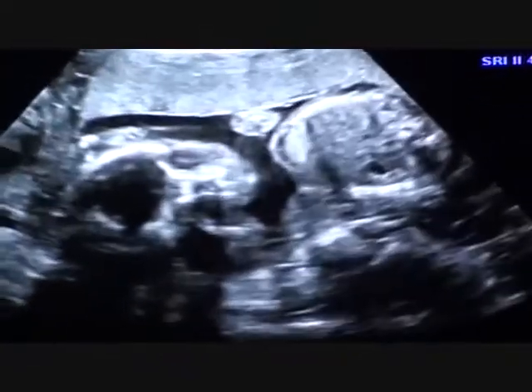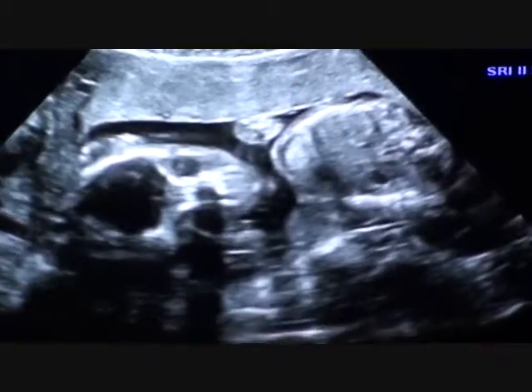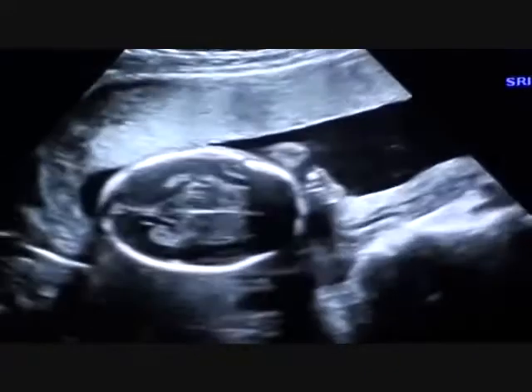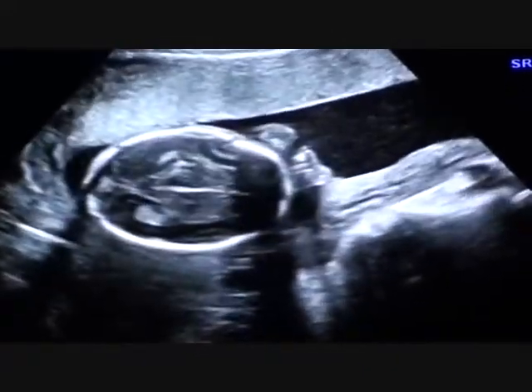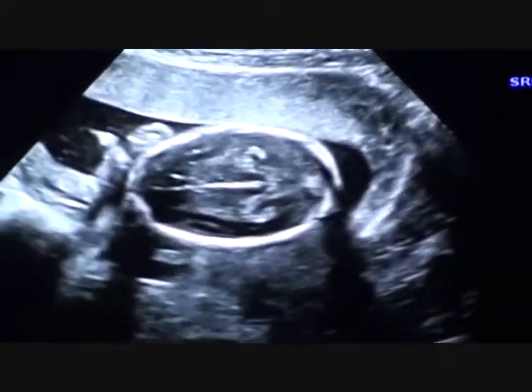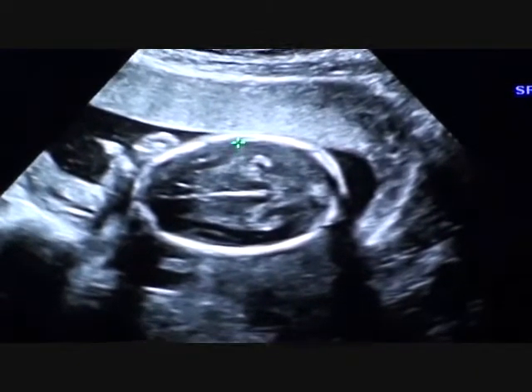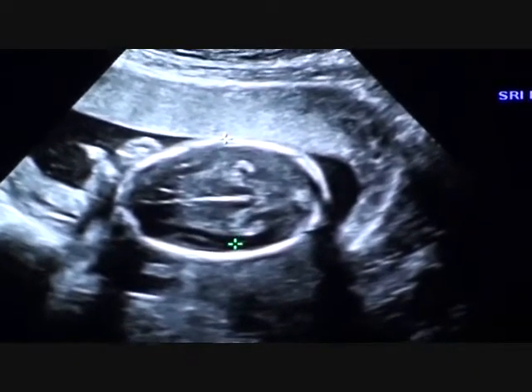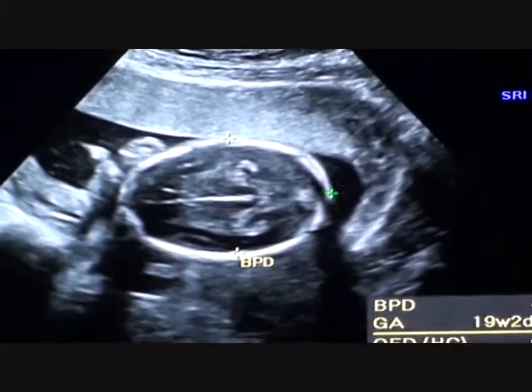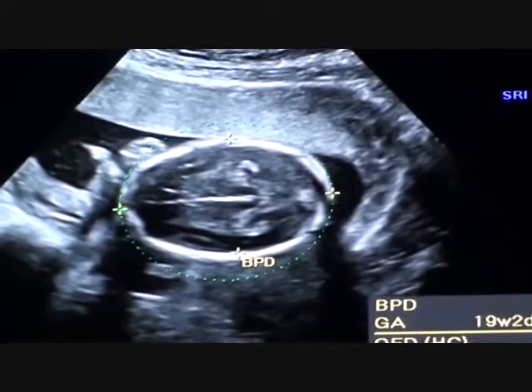There's a little face again. I'm going to go ahead and get all of our measurements here. This is the top of his head. Have you thought of a name since I last saw you? His name's Hudson — Mr. Hudson. Now you got it figured out. The very top of his head, all this looks very nice. That's the brain you see inside. Top of the head here, side to side, back of the head to the front, all around.